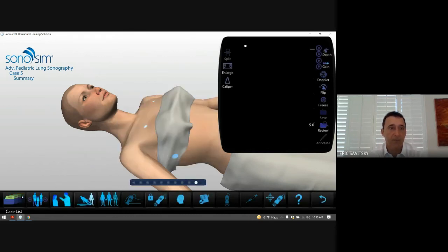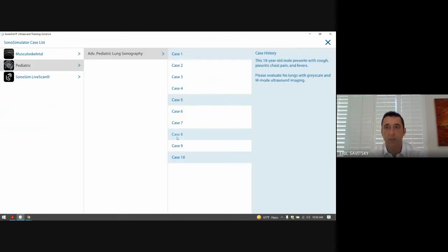Last case that we'll do is we'll pick this one.